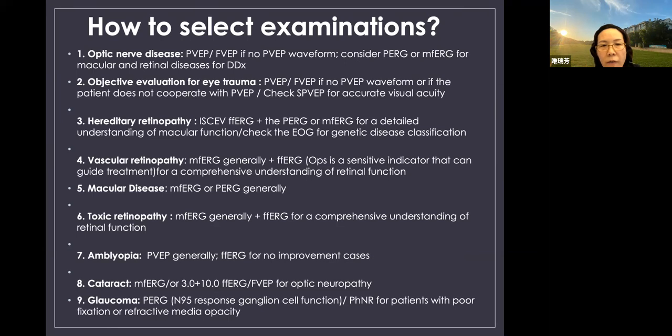If the FFERG is non-recordable or if it's normal, we also need to do a pattern ERG or multifocal ERG to know if only limited cone rod is left, or if the disorder is too severe, we really do not have any recording.